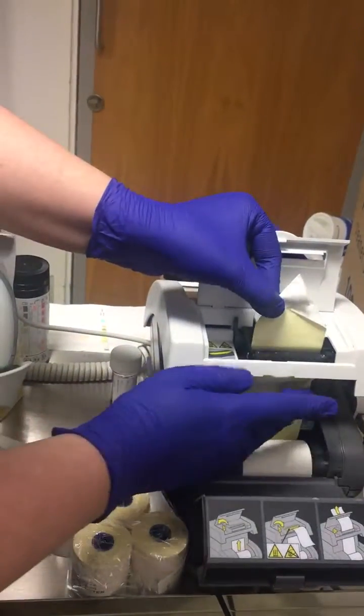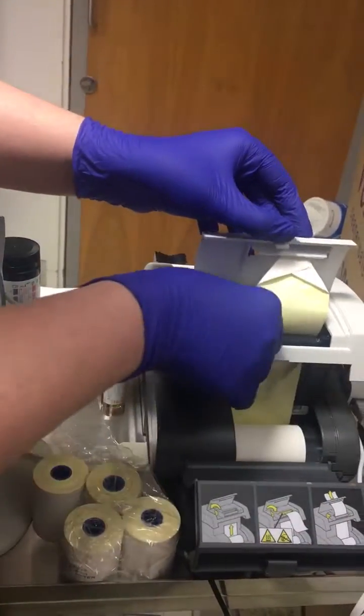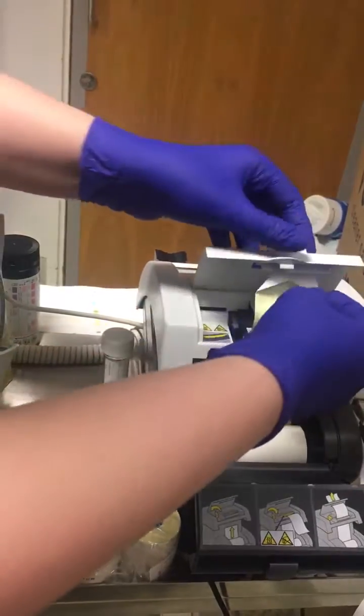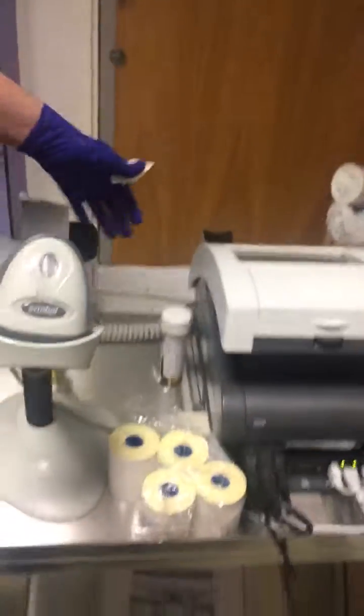Then you have to feed it through this top bit. Don't forget to shut your lever, feed it through the top, and then you're good to go.